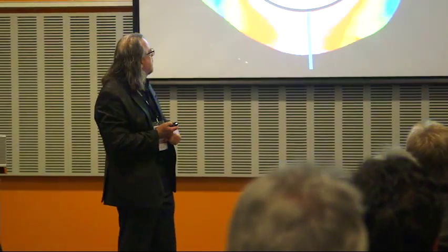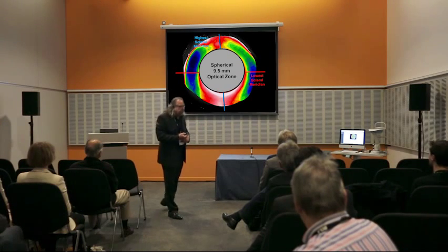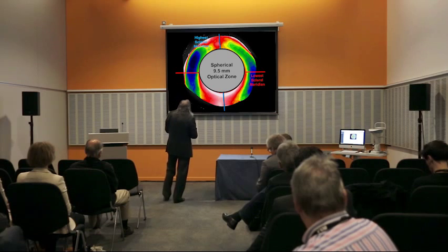Now, let's take a look at this particular patient with what we might refer to as against-the-rule scleral toricity.